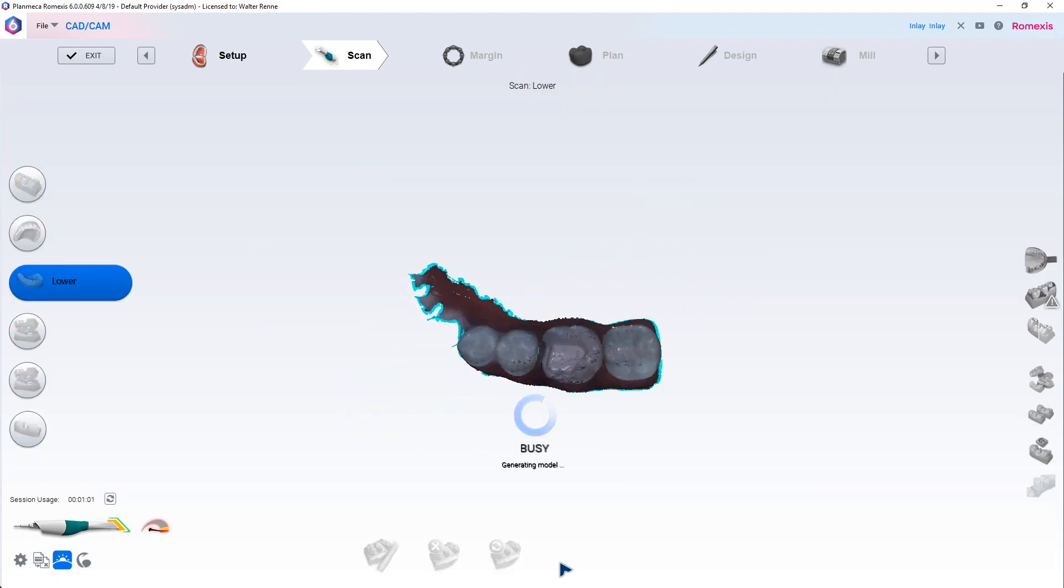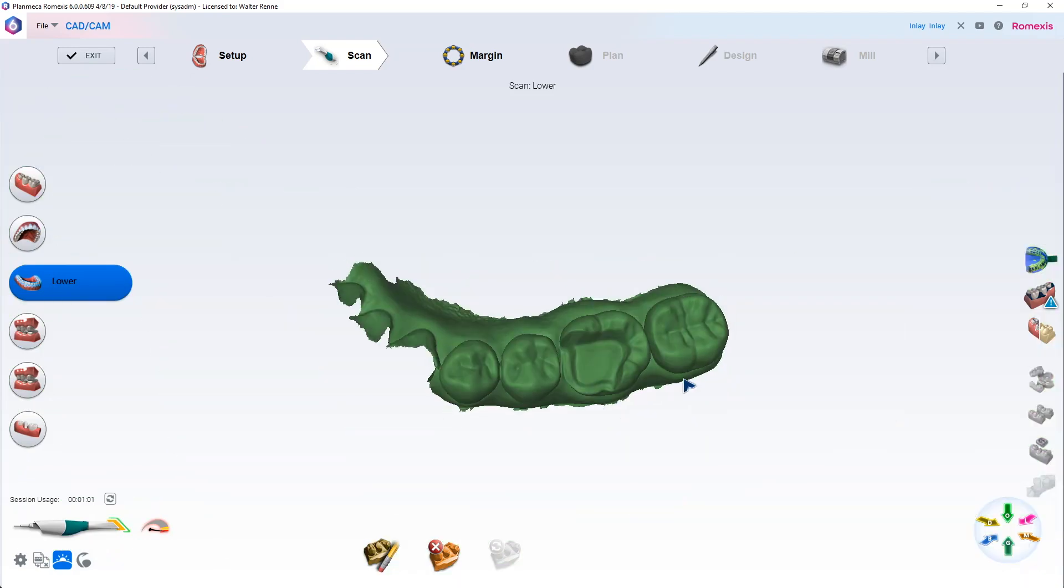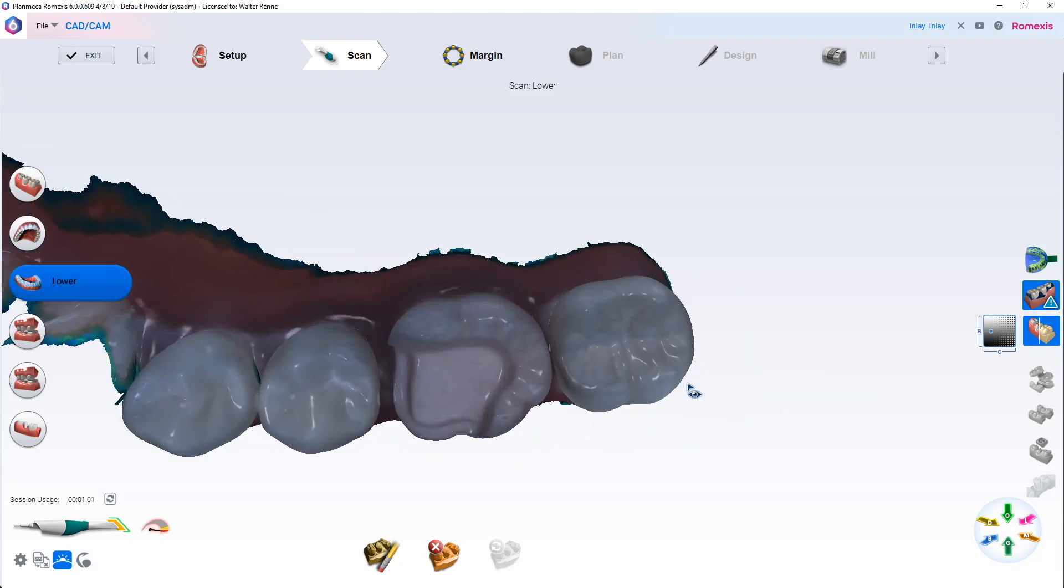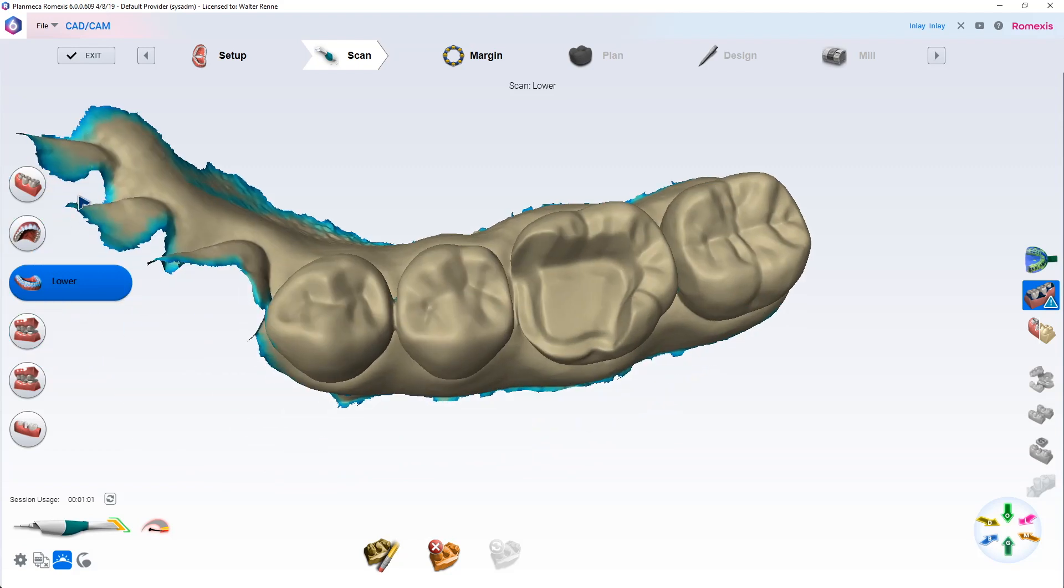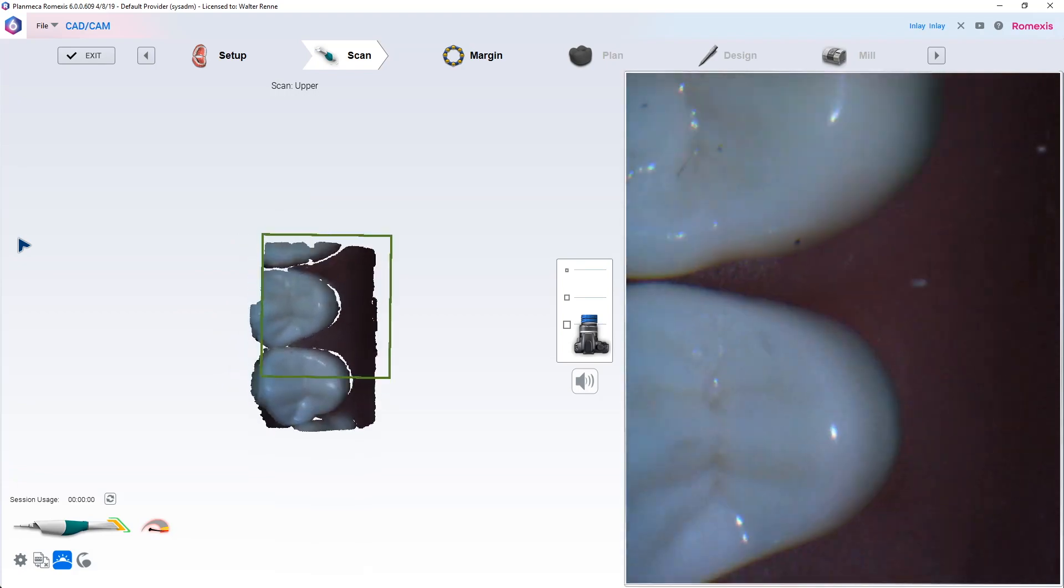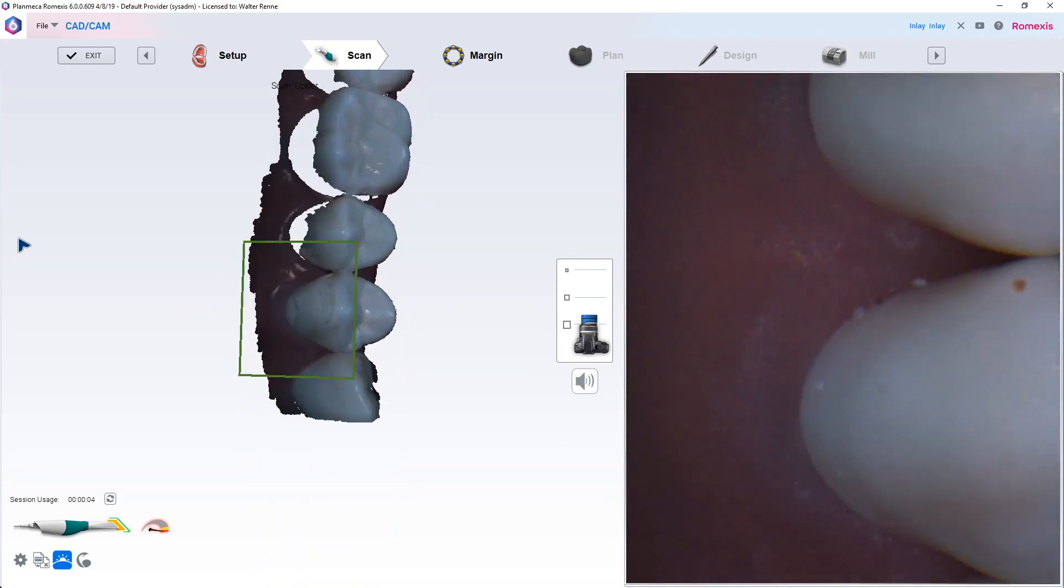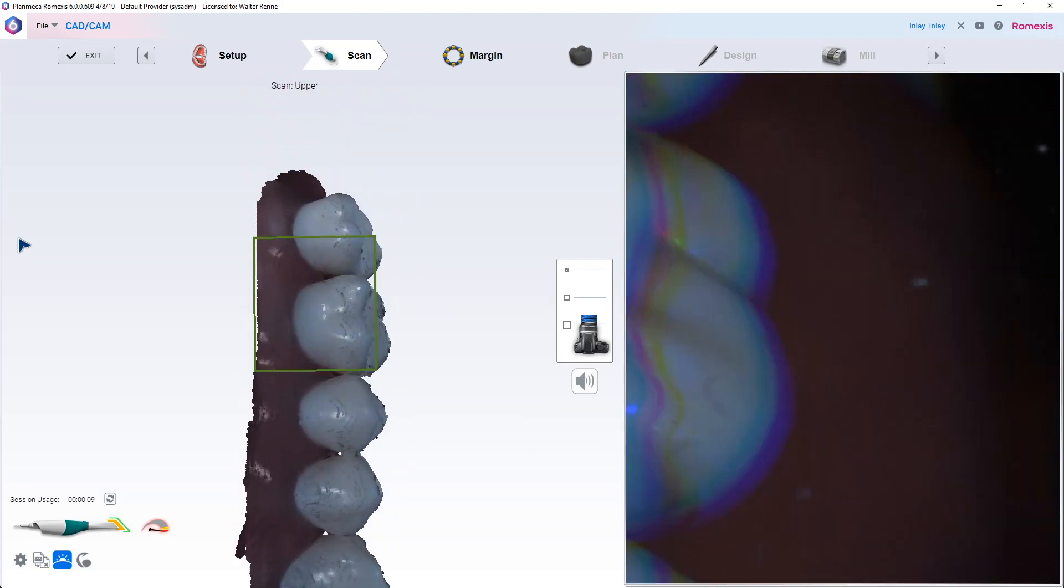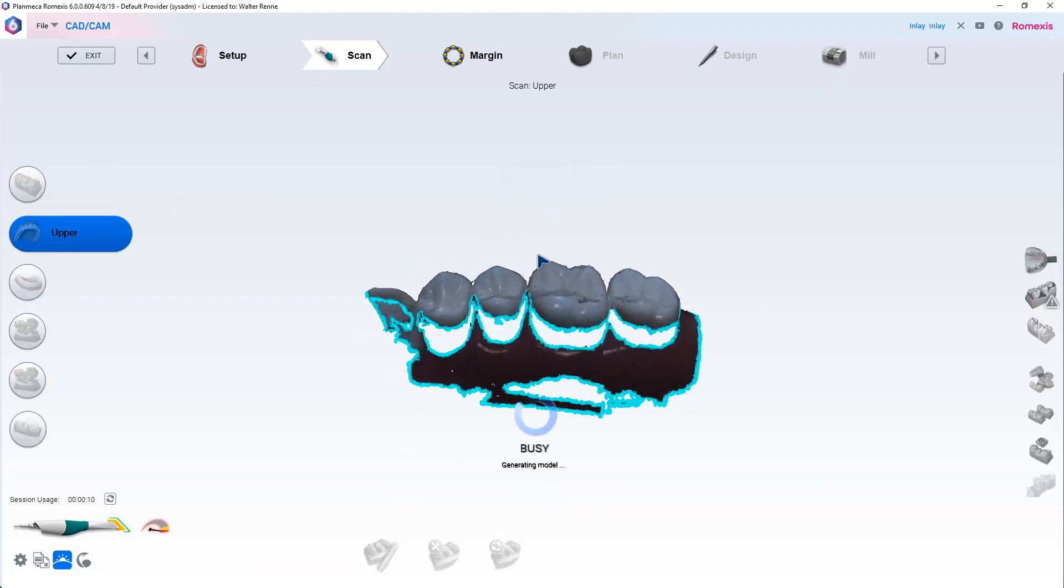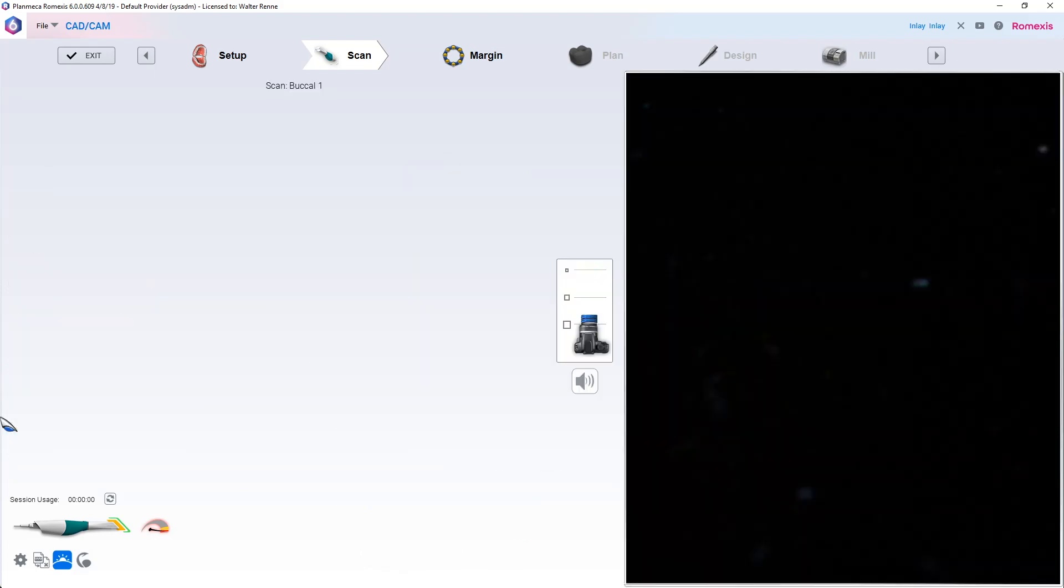That probably will do it. Let's take a quick peek and see how we got. Yeah, that already looks better. Good. Okay, same thing with the opposing. We're going to go ahead and look at that opposing and just scan the occlusal and the buccal. Let's do that now. Notice that when I'm scanning the type, that little blue icon is highlighted underneath the camera icon on the bottom left screen. That's turning the brightness down a little bit.